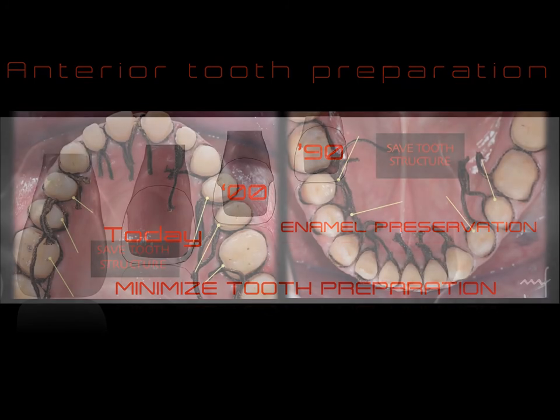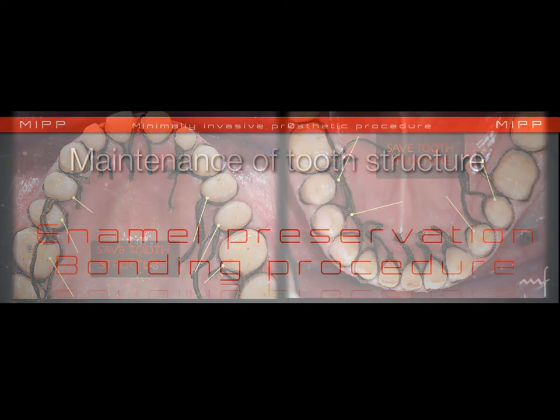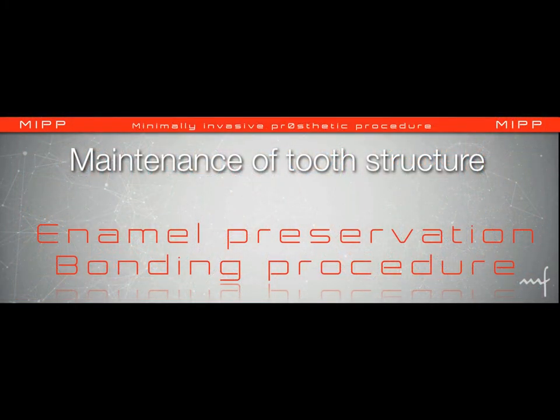Now going back to the case, you can see the preparation modalities and thickness. You can appreciate that we have, of course, added some composite on the dentinal area. Plus, you can see on the occlusal surface, the anatomy of the tooth is still there. We have saved the tooth structure. We have minimized the tooth preparation. And that's our preparation that I made more than 8 years ago. Today they are even more minimal.